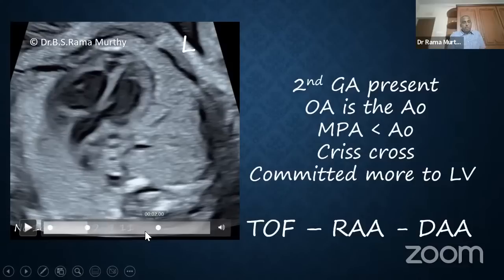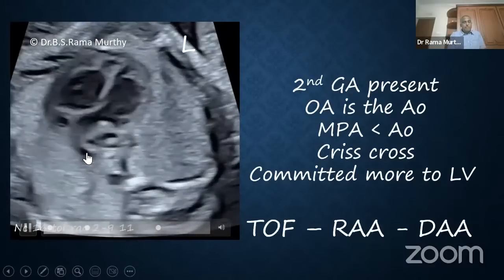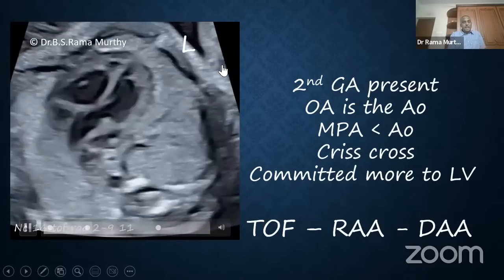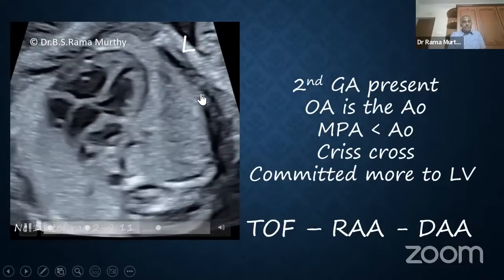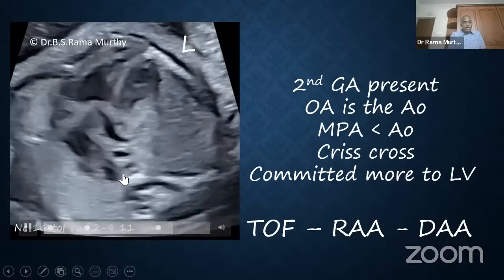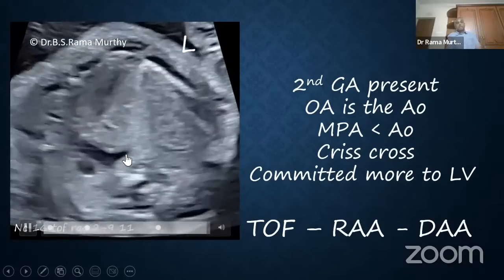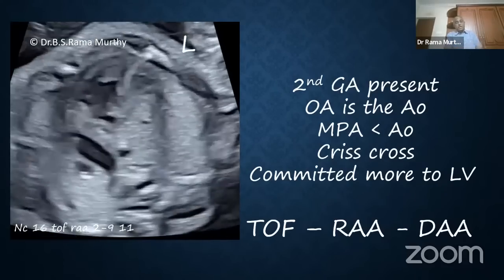And also the third bookmark, a very important bookmark, showing us not only the bifurcation of the pulmonary artery, narrow pulmonary artery. That is the trachea. And I just want you to see the trachea and its relationship to the overriding artery. This is situs solitus. This is left. This is right. So the arching artery is going typically it is going to the right of the trachea. So you have a right aortic arch, right?